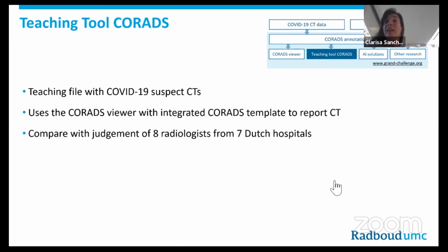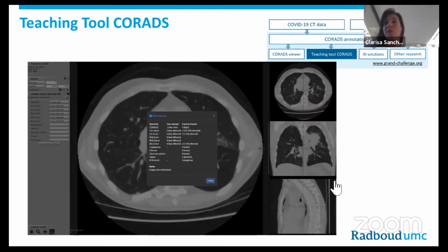Based on this viewer, we also created a teaching tool, especially because this was requested by our clinicians, that it was important also for them to learn how to score following this reporting scheme. So what we did is incorporate a way that you can add your answers, and then you can compare those answers with the ones done by 8 radiologists in 7 Dutch centers. This has already been used within our hospital.